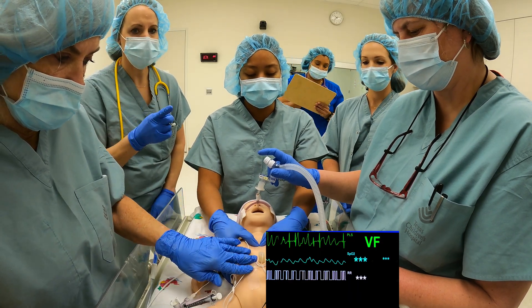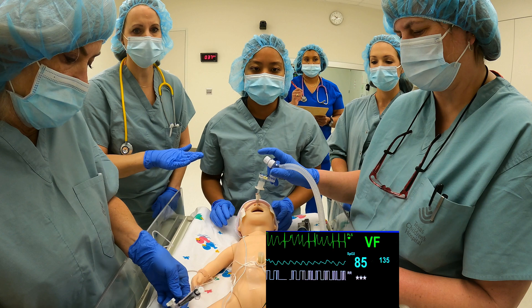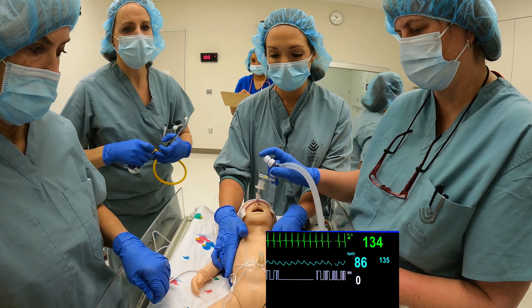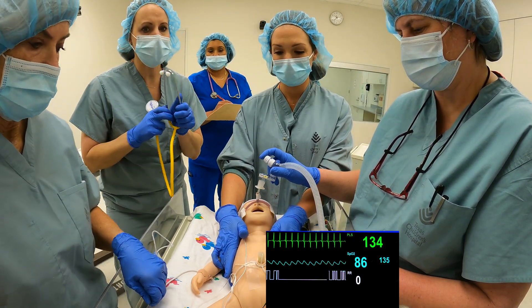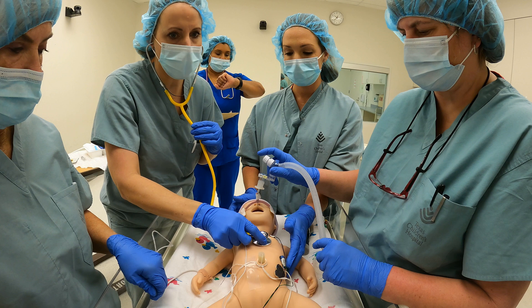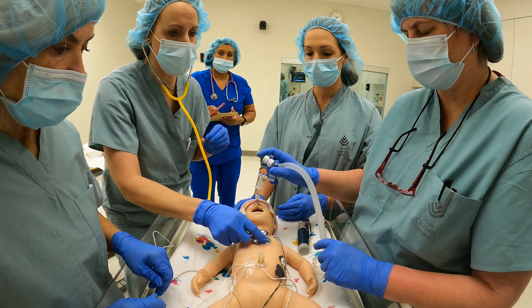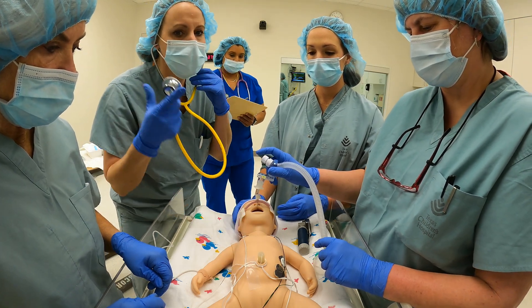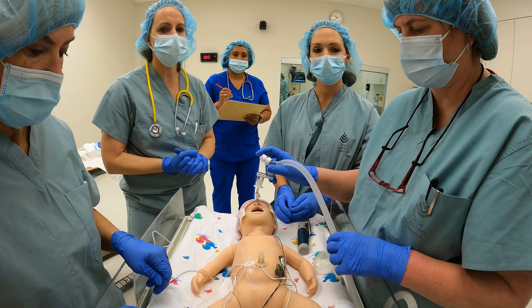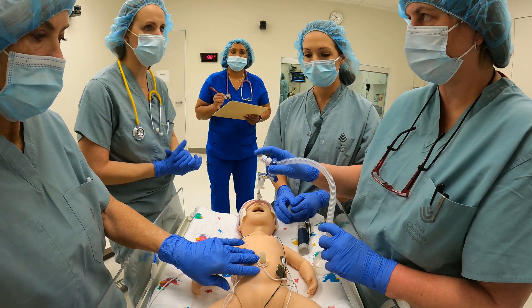I can't tell on the monitor if our heart rate has improved with compressions and epinephrine, so let's pause and continue ventilations while we reassess. The ECG leads are showing the heart rate is above 100. I'm going to confirm with auscultation. I hear audible beats and the pulse ox is picking up. That electrical activity on the monitor represents functional heartbeats and not pulseless electrical activity. Can we start weaning the oxygen to our target saturation goals? Good work team. Let's get this baby ready to transfer to the NICU.